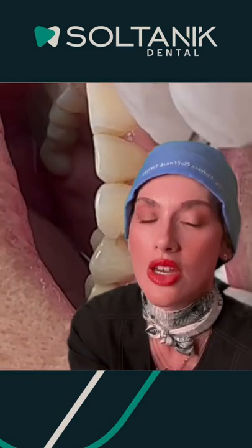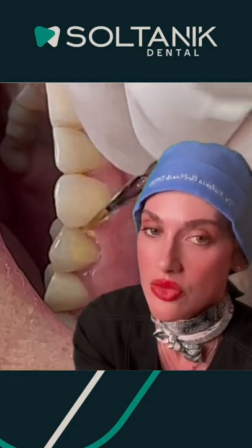Hello everybody, I'm Dr. Valeria Soltanik. Here in this video you can see how Dr. Fernando Soltanik is giving special coloring to these two old ceramic crowns.